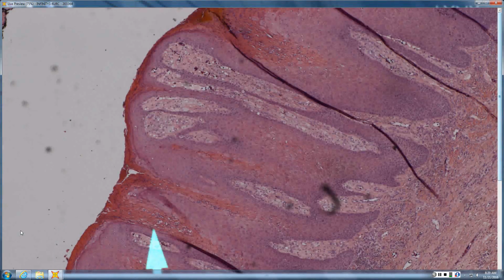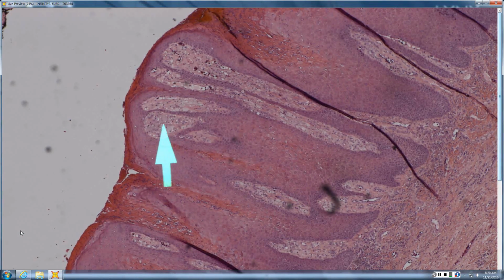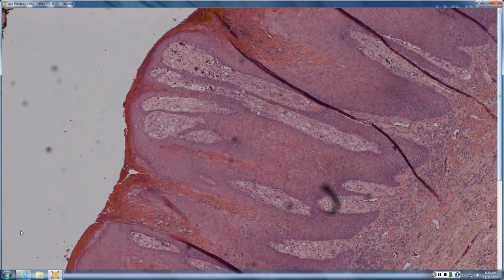See these pink V's? So I put verruciform xanthoma, but I thought you need parakeratosis. It's usually a scale crust on top of it. Pink V's, and the pink V's are filled with neutrophils, and they're pointing down like arrows at the xanthoma cells below, which can be pretty subtle. Here you can already see them at this power in the papillary dermis. They can be more subtle than that. But in an acanthoma with pink V's filled with neutrophils, verruciform xanthoma should be top of the list. Oh, crushed.